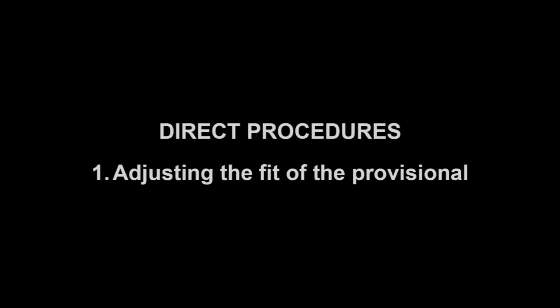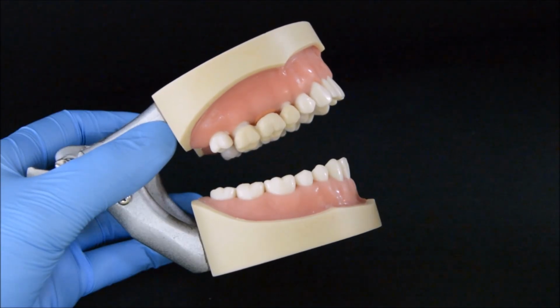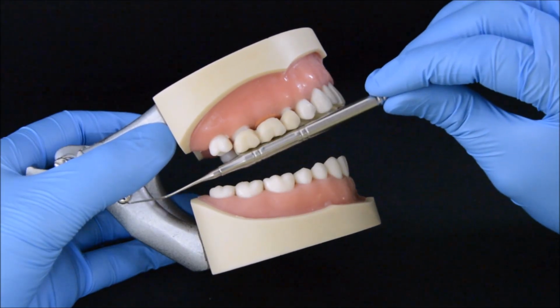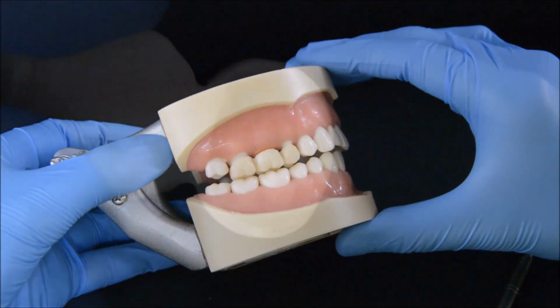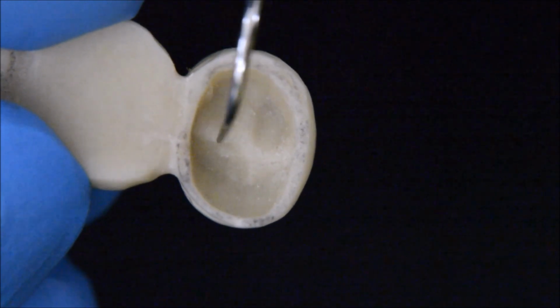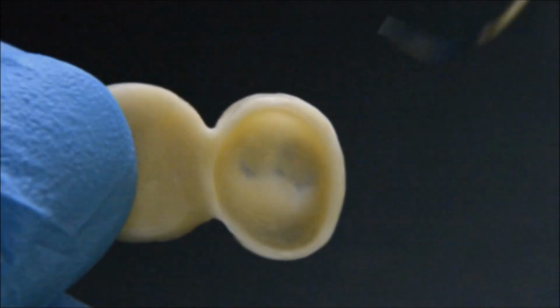We shall now move on to the direct procedures that will be carried out on the prepared teeth. It will be seen that the provisional obtained from the laboratory will not seat accurately on the tooth preparations and may result in open margins and inability to close the mouth. Thinning out of the inner walls of the retainers and removal of the internal occlusal grooves will help in a better seating of the provisional and a more complete closure of the mouth.